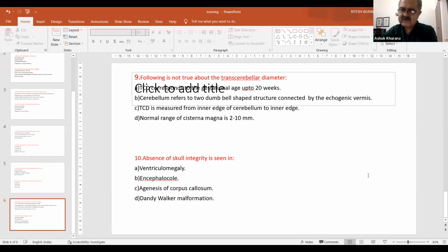Yes, I think it needs to be used everywhere, in the labor room, in the ward, as well as in the OPD, the outpatient section. We should add up not just the number of months or years, but the number of hours spent.